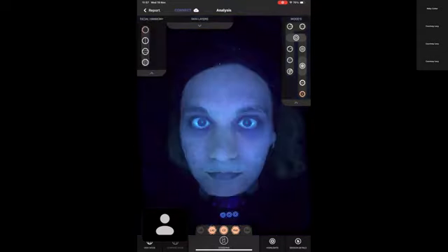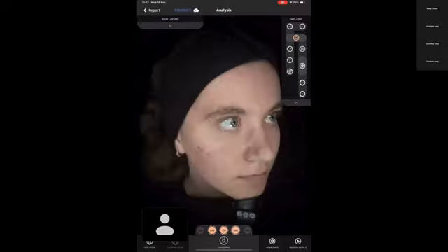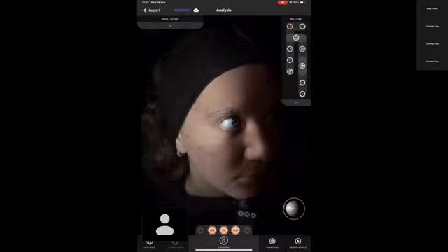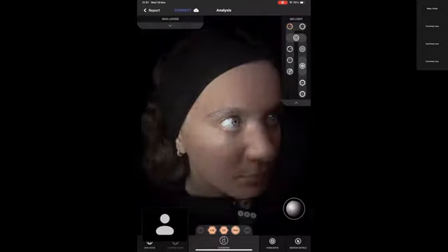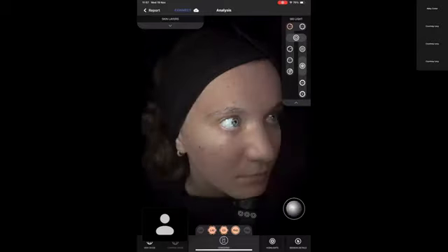Going back to the center, I can go onto the daylight, which is like my standard, and I just want to show you the 360. Might actually show it on the side. Here we can really use this toggle and really focus in on certain areas to show the patient parts of their skin which they may not have noticed before.